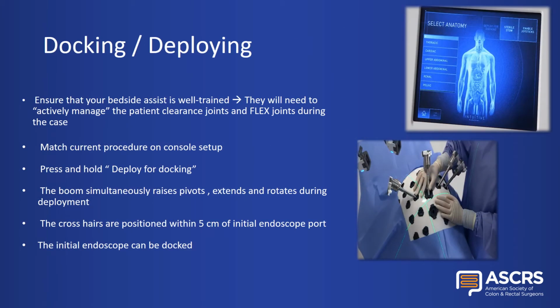Docking and deploying. Ensure that your bedside assistant is well trained. They will need to actively manage the patient clearance joint and flex joint during the case. Match the current procedure on the console setup. Press and hold deploy for docking.